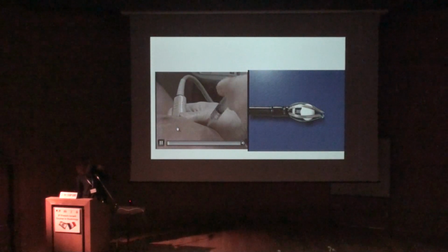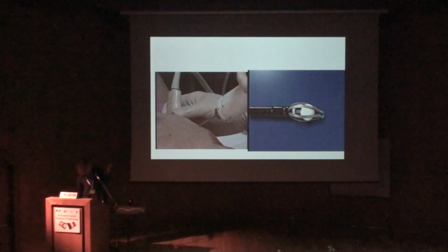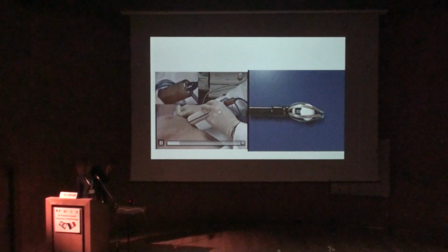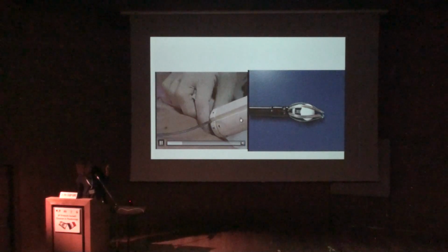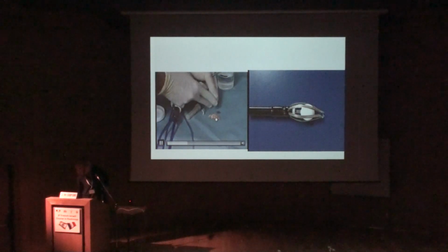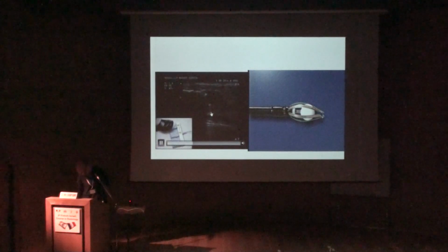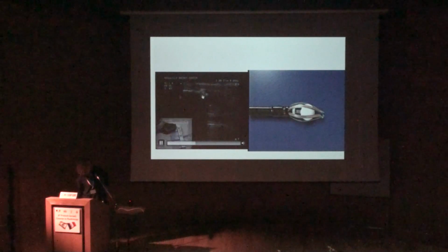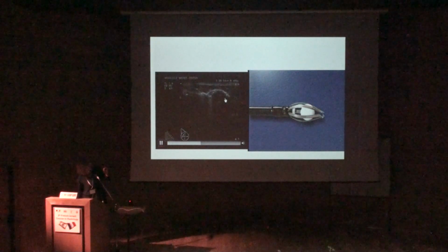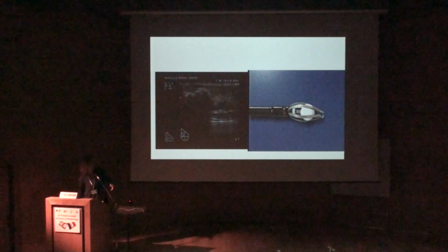This is ultrasound guidance. And I'll show you the comparison; this is a vacuum-assisted biopsy with a 9-gauge needle. And in this technique, small pieces of breast are accumulated in this small container. Those are the pieces in a vacuum-assisted biopsy. And in the Intact system, again ultrasound guided, you use the needle. It takes 10 seconds. The basket is open. It encapsulates the lesion in 10 seconds, and the procedure is done. And it is done under local anesthesia.